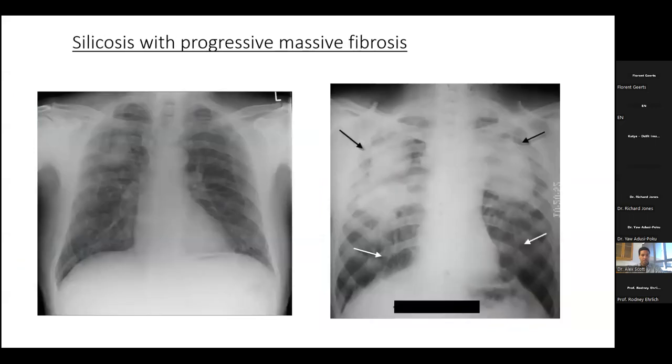Silicosis can present as huge masses. The one on the right, that's our right, is a very unusual picture. There's not much that looks like that. There are absolute masses which are symmetrical. But when you get asymmetrical masses, it could really be many things, cancer, TB, and a few others. Next slide, please.